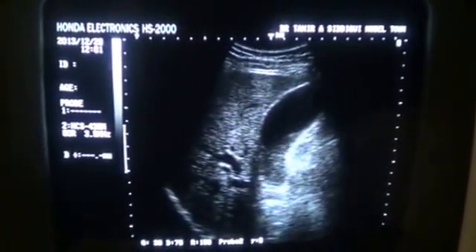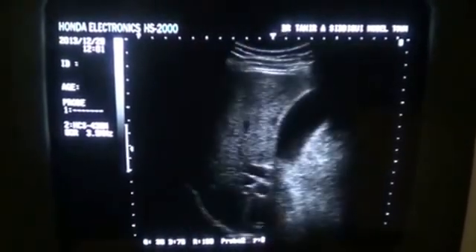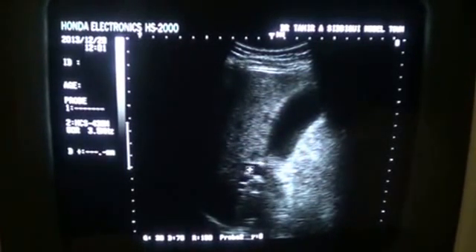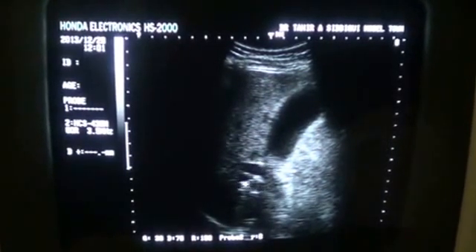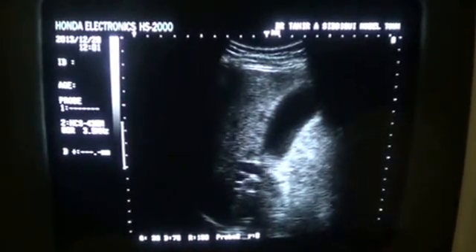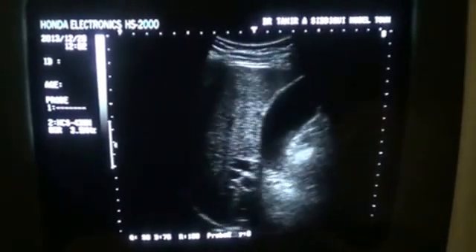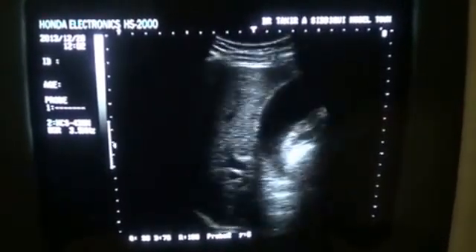This is the gallbladder. And here you see a double barrel sign. This is the portal vein. This is the common bile duct — the common bile duct is dilated. And whenever the common bile duct is dilated, you will see a double barrel sign.